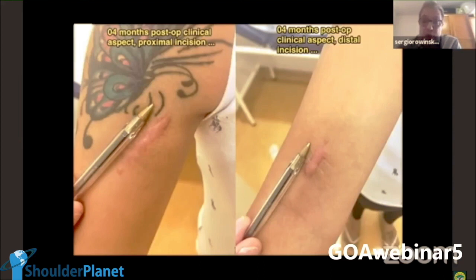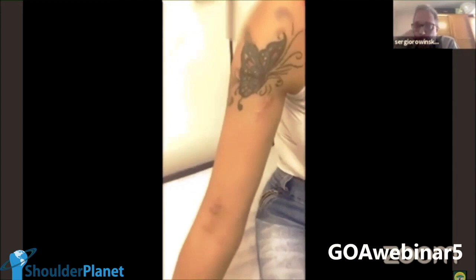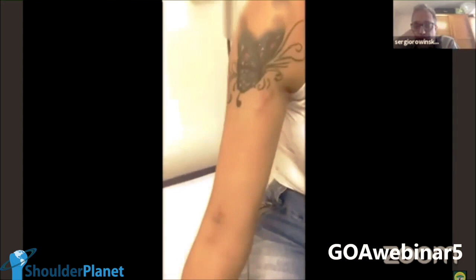So what about the clinical results? I'm talking in the video, so let's see and listen to my voice. Six months post-op, anterior bridge plate, operated on 29 December 2016. Very small incision.